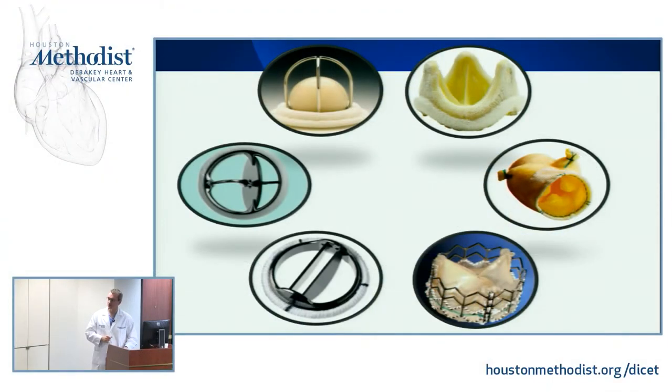So this is really the challenge, and this concept keeps changing. We're not doing any ball cage valves. A couple of those patients still exist. We're not doing too many of these. We're doing more and more of things like this. That we're not putting in anymore, but we're on version 2, 3, and 4 that are bioprosthetic surgical valves that keep changing as well. So an absolute certainty is in the bioprosthetic valve field, what you're used to imaging today will not be what you're imaging in 3 years. It's changing very quickly. So you can't ever really memorize all of the dynamic features of every prosthetic, every color feature of every prosthetic. You just have to hang your hat on some basic principles of flow, and that's what we'll talk about.